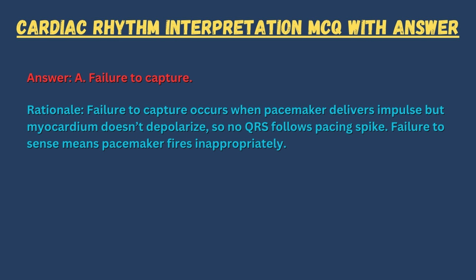Answer: A. Failure to capture. Rationale: failure to capture occurs when the pacemaker delivers an impulse, but the myocardium doesn't depolarize, so no QRS follows the pacing spike. Failure to sense means the pacemaker fires inappropriately.